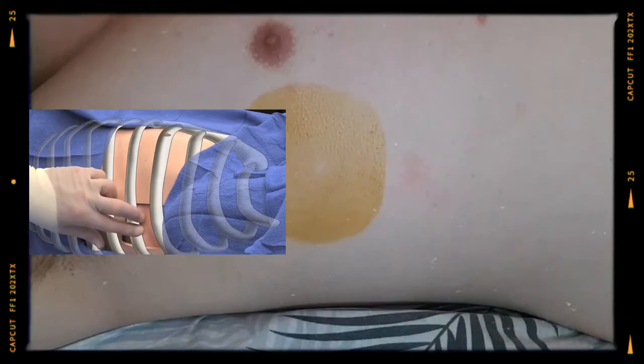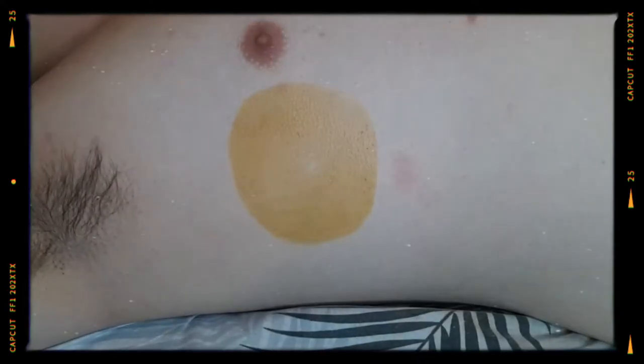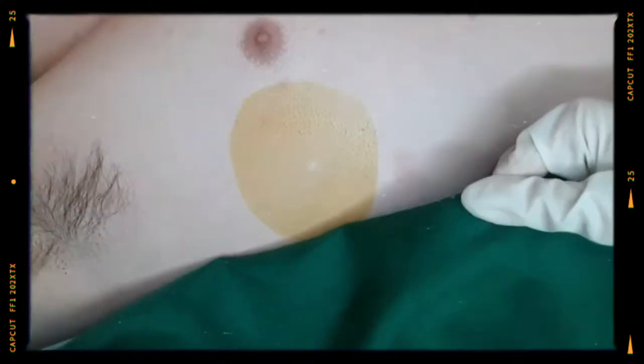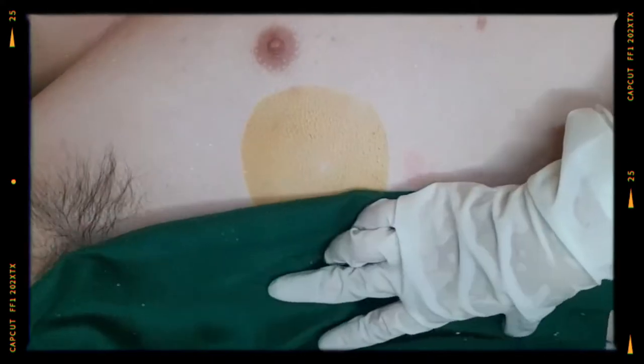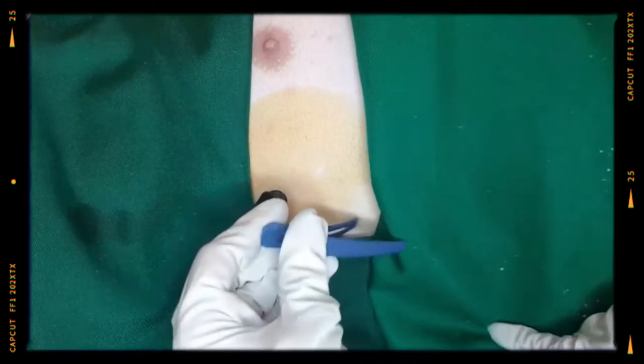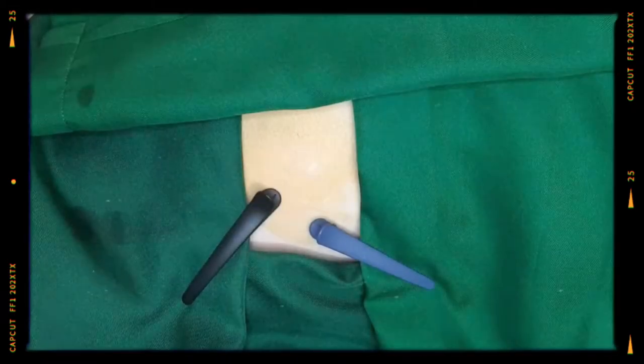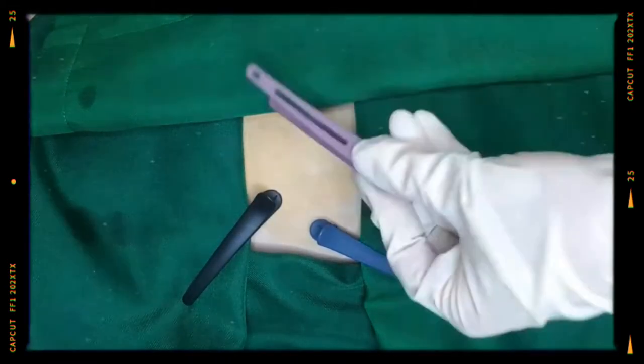Next, we drape the area with four towels, not with a single fenestrated sheet. Drape first at the site of the surgeon, then place the other towels, cephalad and caudad. And the last towel should be placed at the opposite side of the surgeon. Secure the towel with towel clips.